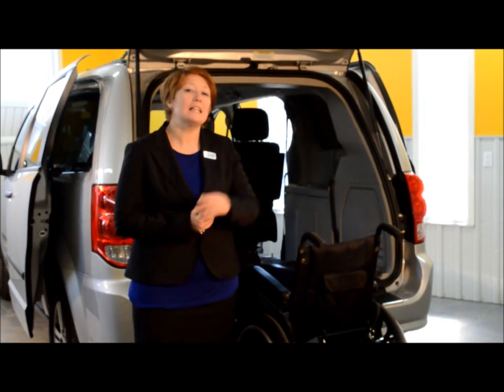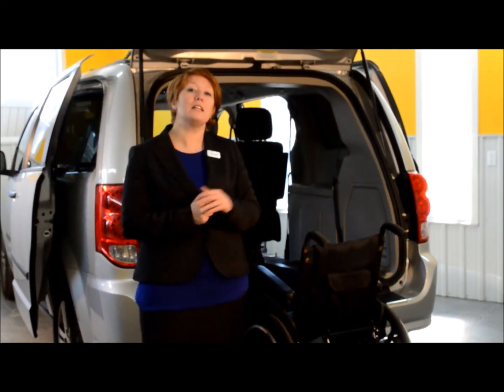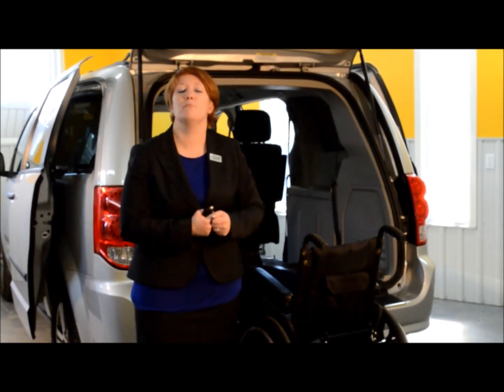A few points to check before you install the Power Pull is the combined weight of your client and their mobility device to make sure that it fits versus the capacity of the Power Pull. Another thing to note is whether it's being used by an independent driver, perhaps in a side entry conversion, that they're able to properly and easily maneuver the hooks and the straps onto their wheelchair.